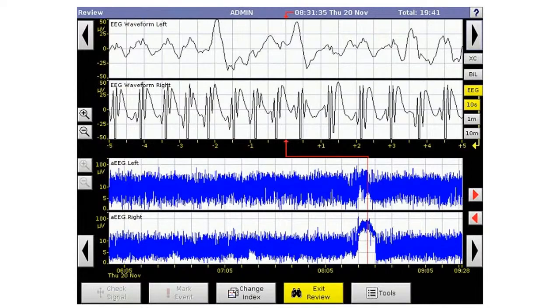Then not until a few minutes into the seizure does the upper amplitude also begin to be influenced. As the seizure continues and becomes more rhythmic, the differential between the voltages of the seizure becomes smaller and smaller. This is what causes the compression or the thinning of the aEEG band.